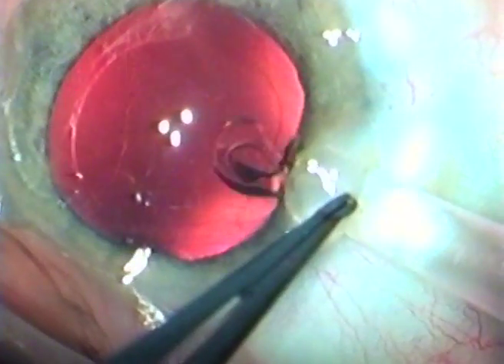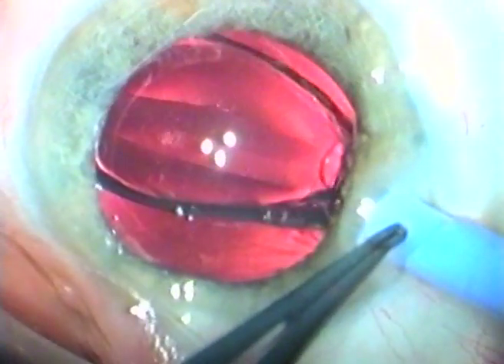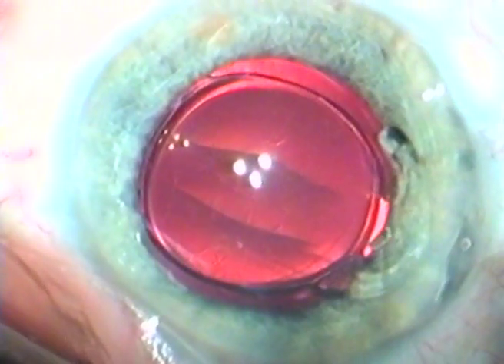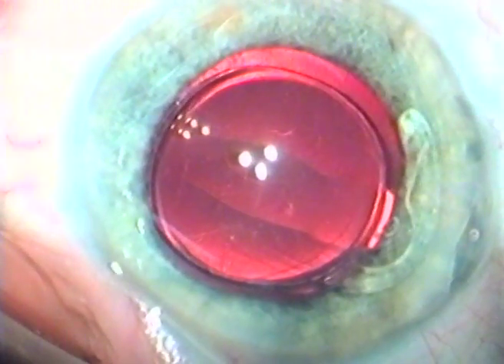The lens should move easily and progressively through the injector nozzle before emerging from the tip and entering the capsular bag.